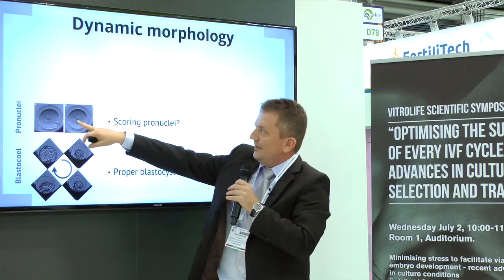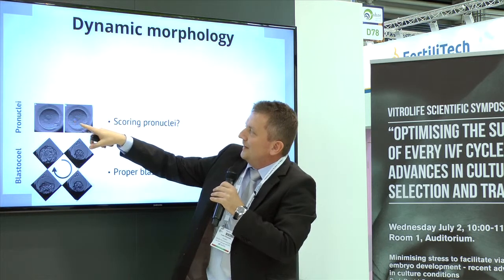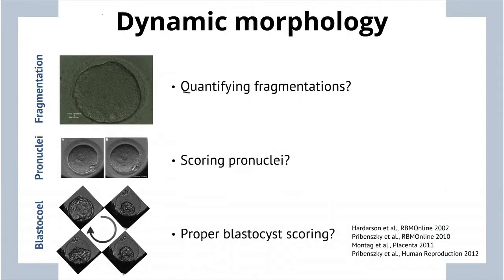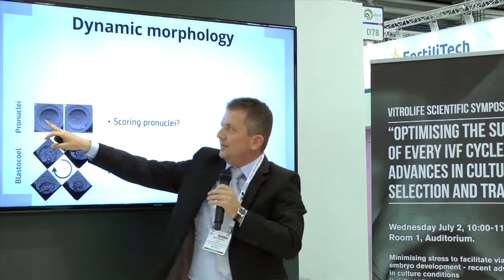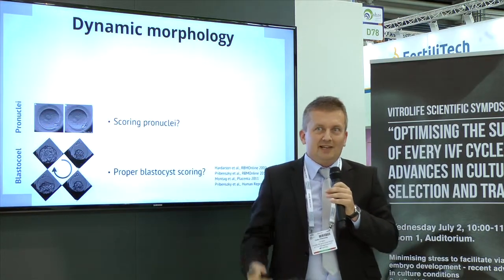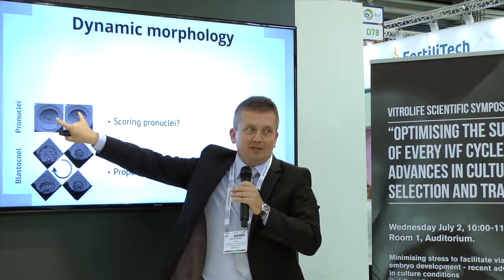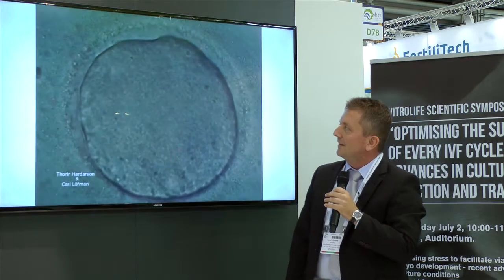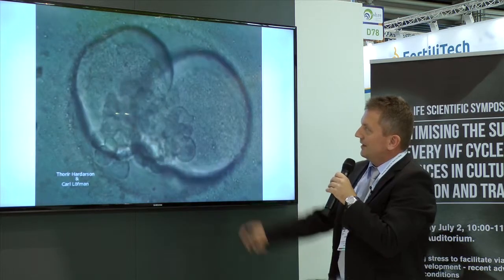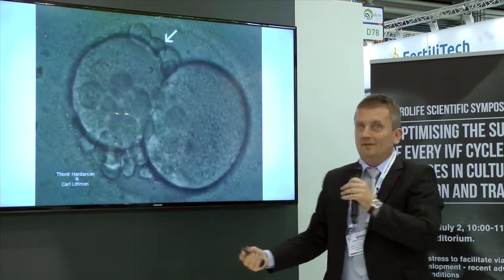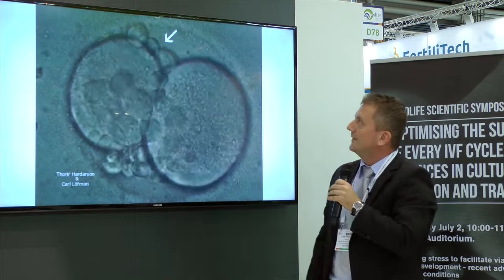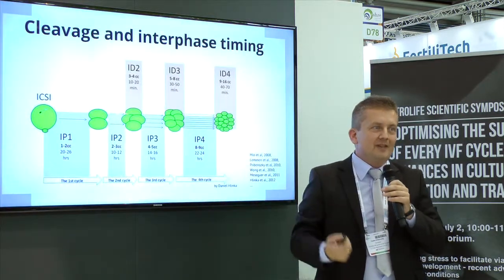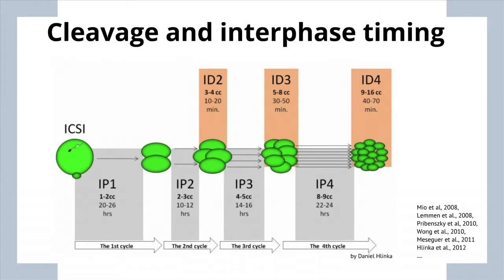If you had sharp eyes, you would see the pronuclear particles here and how they are arranged. This embryo — they are aligned nicely. This one is completely asymmetric. So the Z score of one embryo would be Z1, the Z of this embryo would be Z2 or Z3. You would say they are two different embryos, but they are not — there's only one and a half hours between them. Without time-lapse, I would not dare to score them. Also, fragmentations are dynamic as well — proper judgment of fragmentation is only possible with time-lapse. You can see a fragment going back into the blastomere.